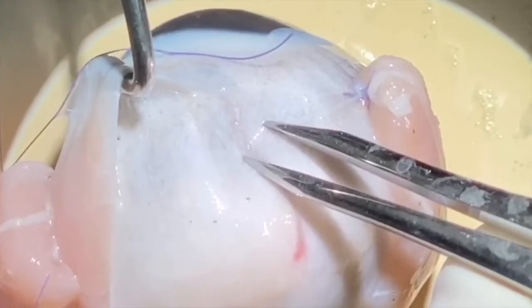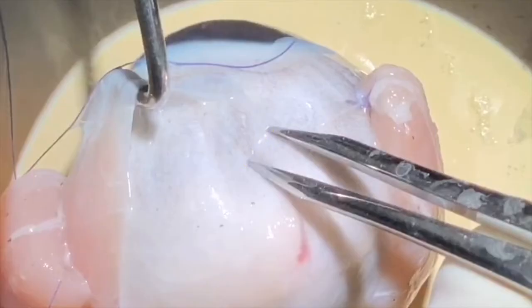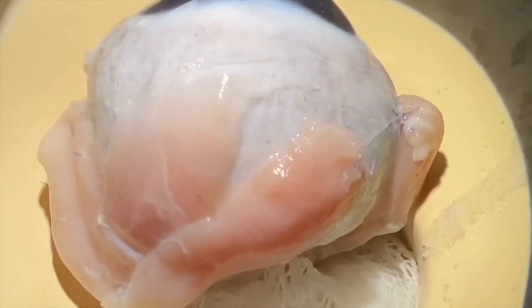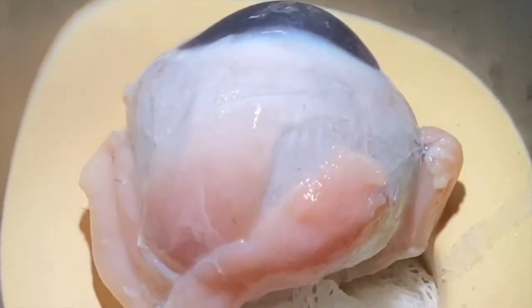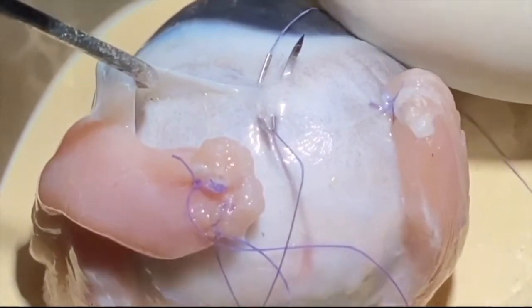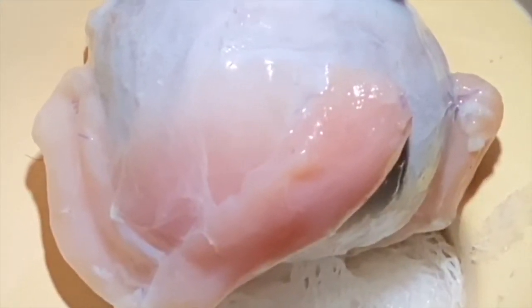For performing the Parkes recession, a mark is taken 2 mm lateral and 3 mm posterior to lateral end of inferior rectus insertion. The disinserted inferior oblique is then sutured to this point. To perform Elliott and Nankin's procedure, the disinserted inferior oblique is sutured just adjacent to lateral end of inferior rectus insertion.